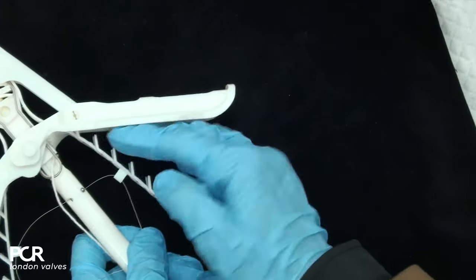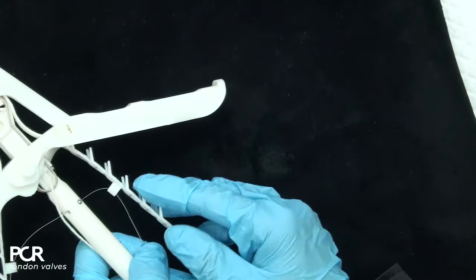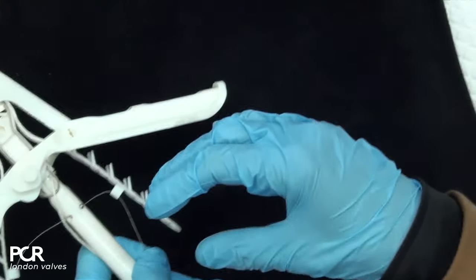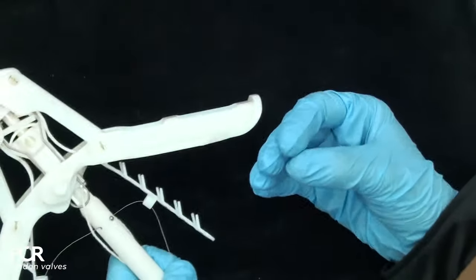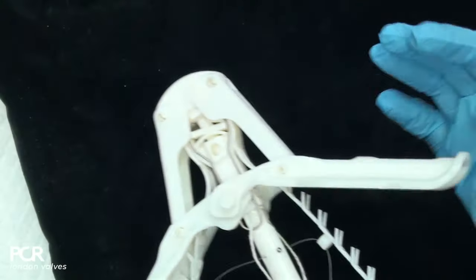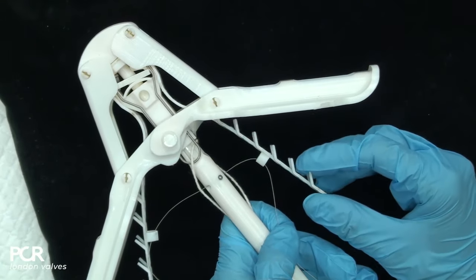So this is the gripper with those frictional elements. And those frictional elements are distributed along the full length of the gripper, which means they're not concentrated in one area. If they were concentrated in one area, that would be a stress concentration point. Another key thing is that we have frictional elements on the inner part of the gripper. This ensures that you have maximum leaflet coaptation and maximum TR reduction.